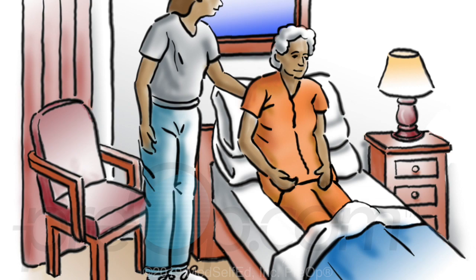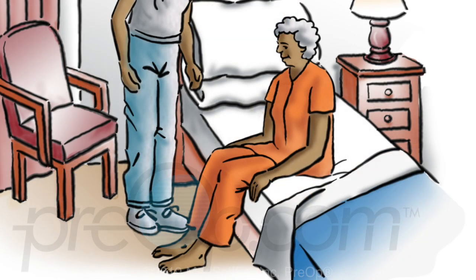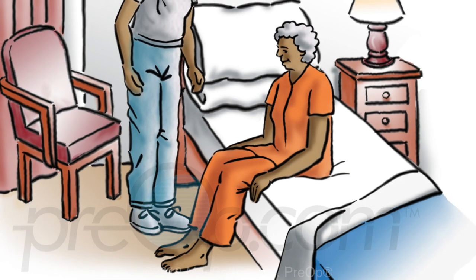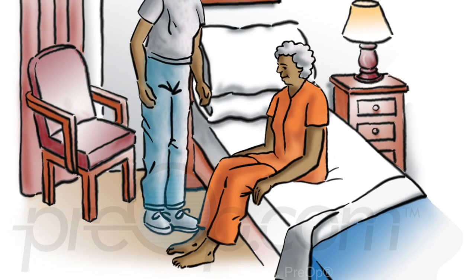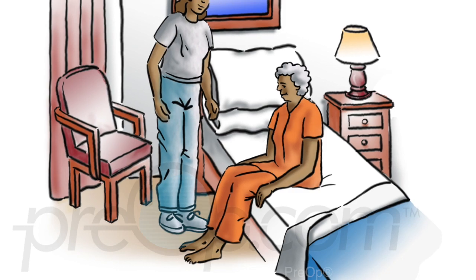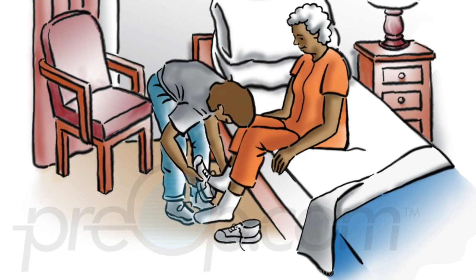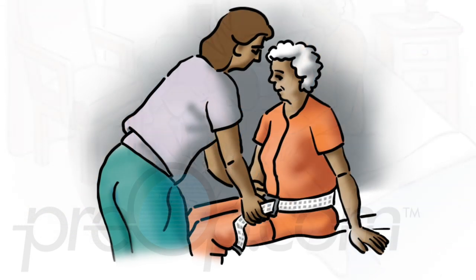If your patient has been lying flat, always sit the patient up for a few minutes before moving out of bed. Help the patient pivot with legs dangling over the side of the bed. Move the bed covers well out of the way. Let the patient sit for a minute; if the patient feels weak or faint, help him back to bed. Help the patient put on a robe, socks, and shoes or sturdy slippers with low heels and non-slip soles.